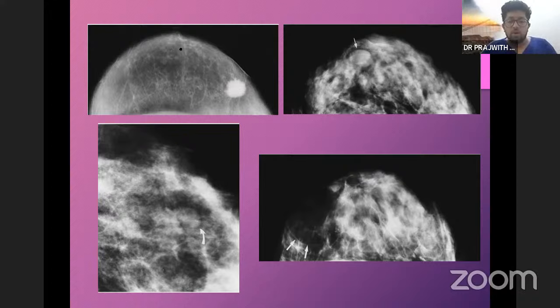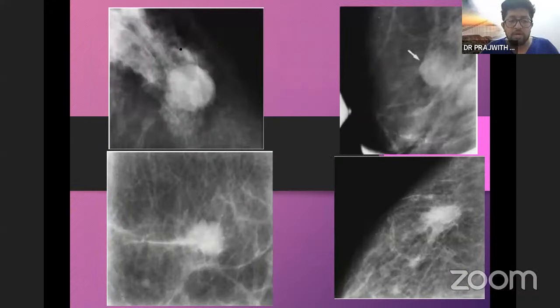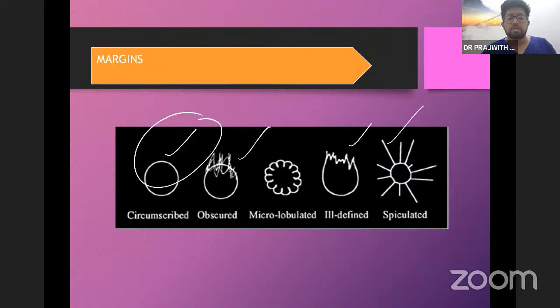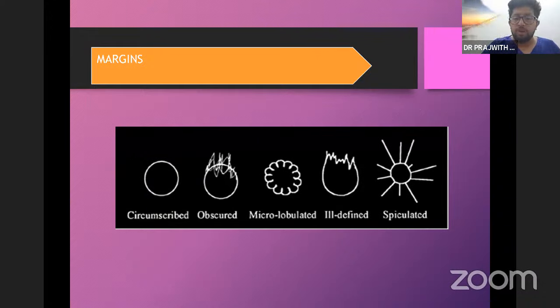Now, all the MCQs that we have covered here. When is a lesion considered least malignant? When it has a circumscribed margin, obscured margin, ill-defined margin, or spiculated margin. Very simple answer: it's a circumscribed margin. So in this pattern, which of them is considered the most malignant feature in a breast lesion?